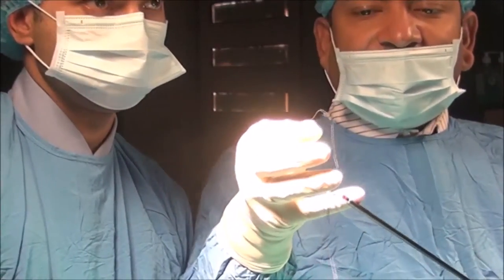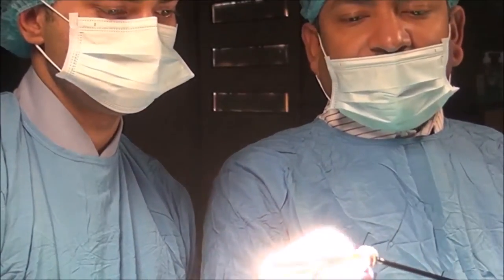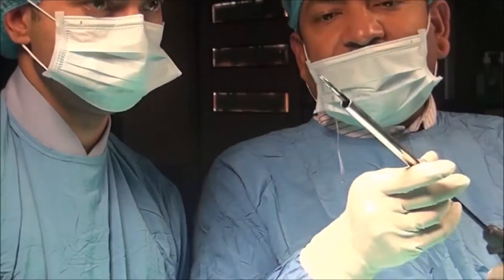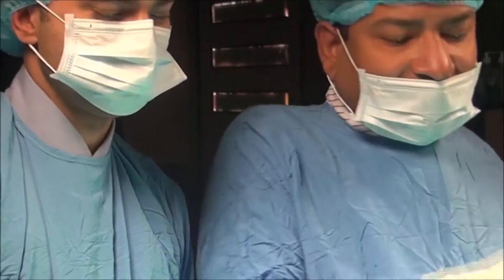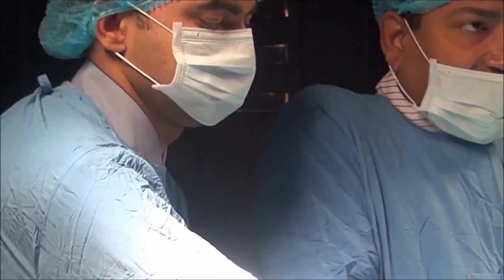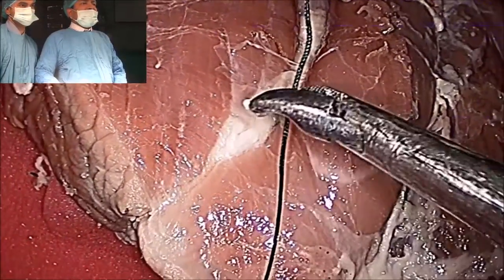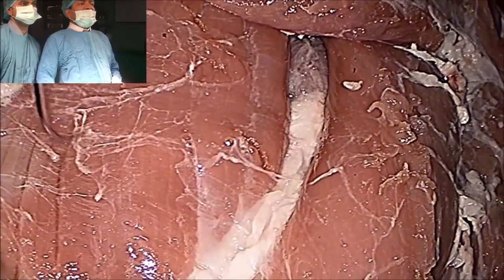You will take the suture from the half. First you will introduce your Maryland into the reducer, and then you will take the suture from the half so that the needle should be hidden into the reducer. You will hide the needle — the needle is endo-ski shape, so easily it will hide. Then you will drop it into the abdominal cavity. You will drop it in such a way that the tip should be towards the left and the tail should be towards the right.